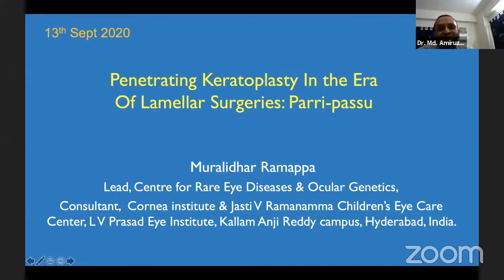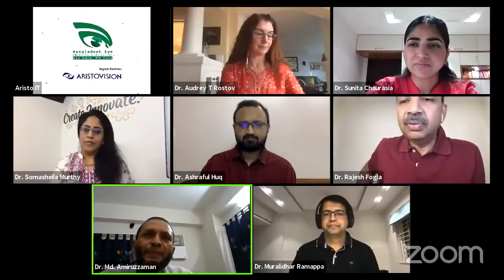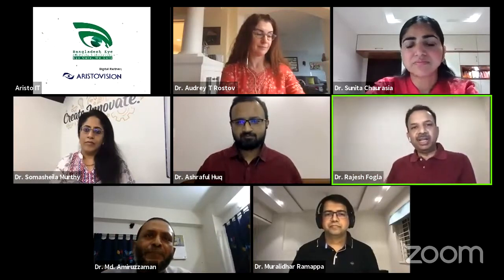Here my question is about the graft size, donor and recipient. We are using about 8.25, but probably Dr. Rajesh Fogla uses the same size, or is there a disparity? For ectatic disorders, we try and use the same size. But for non-ectatic disorders, we can use a disparity of about 0.5. If you are using the manual trephine. If you're using the femtosecond laser, the disparity is only about 0.1 millimeter, because the femtosecond laser is so precise.